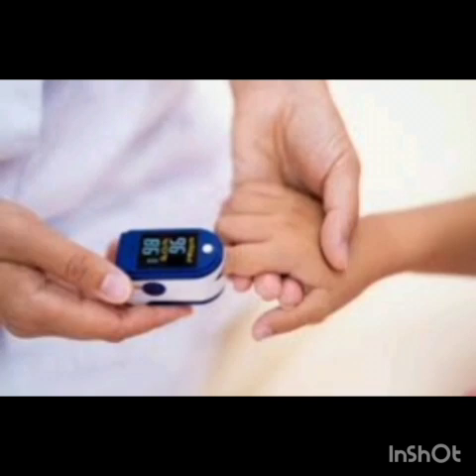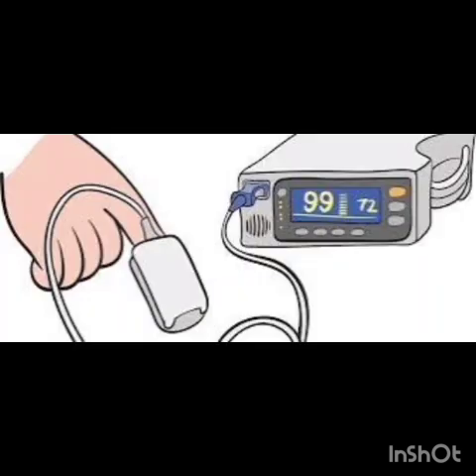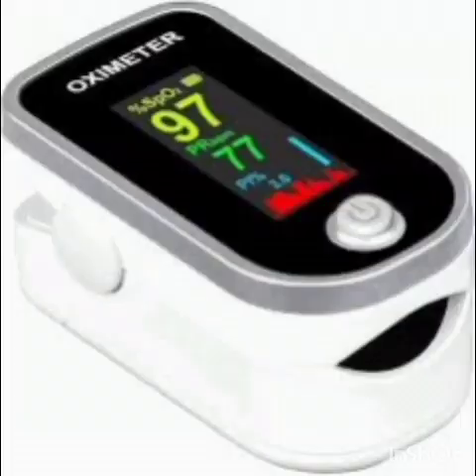What is pulse oximetry? First, pulse oximetry uses two wavelengths. The wavelength of light measures the saturation of oxygen. The light shines through the vascular bed and measures the saturation with the probe. The probe is placed on the thumb, finger, bridge of nose, ear, foot or hand. Calibration is not required for the equipment.